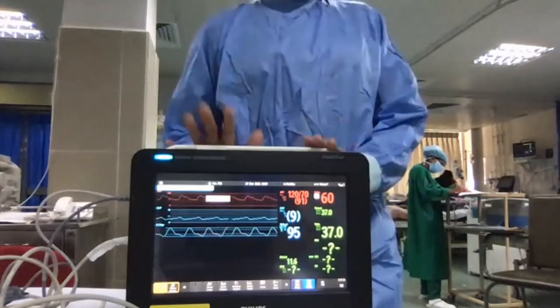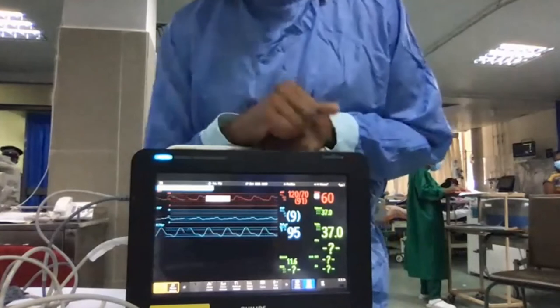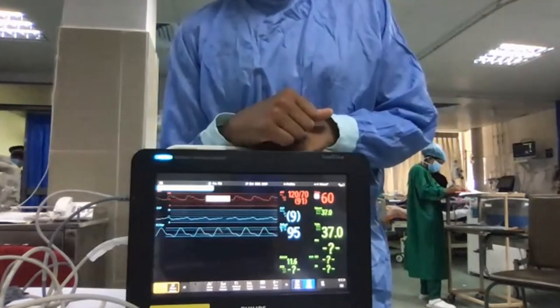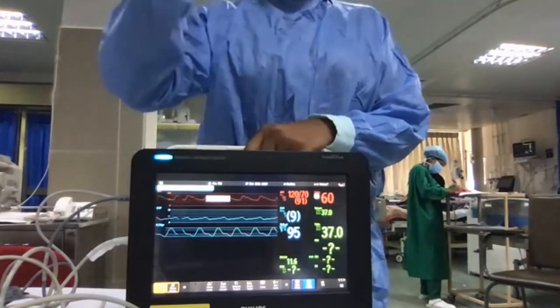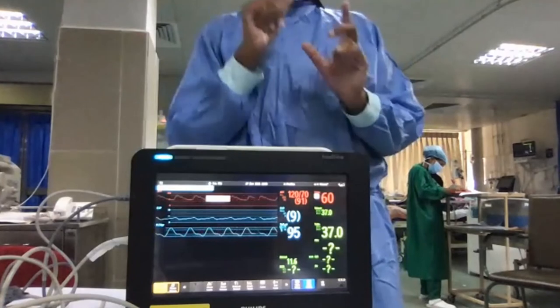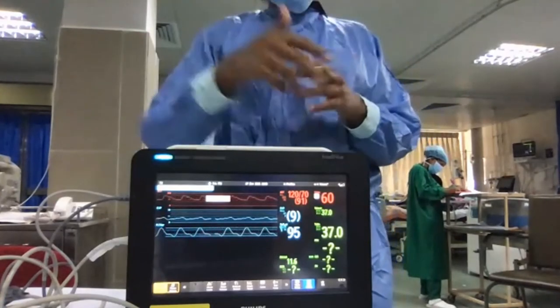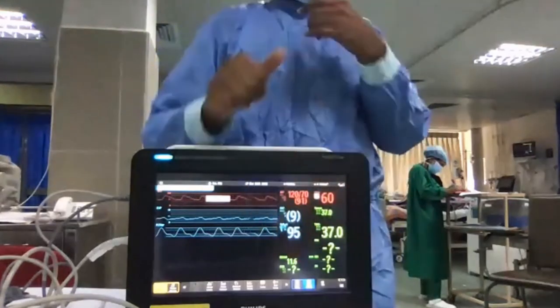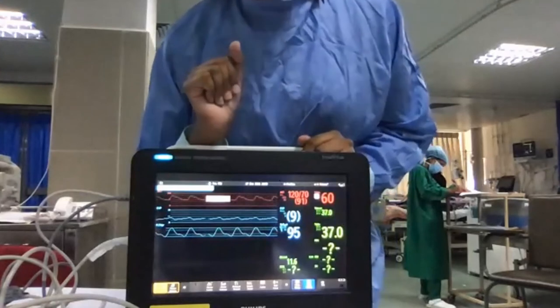So if you set up the monitor with all those numbers, it's okay to have preload, afterload, and contractility, so that we will have all the indexes, the parameters related to those, categorized. I will show you that screen as a picture. I think it is very user friendly for you, rather than clicking on all these parameters. So far, do you all have any questions?